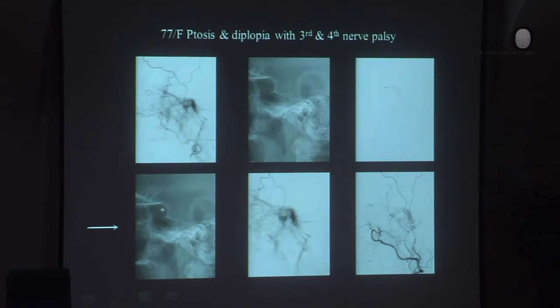Recently, I personally experienced a very strange and serious situation like this, and this is a proliferative phase. We usually touch it minimally in this proliferative phase, but we entered the venous route to reach the flow that comes from this feeder into this area. So I put in just one coil, a hydrocoil, to induce thrombosis. There was a little resistance, but not that tight. And this portion was removed, and I introduced particles intraarterially. And then the patient recovered, but had decreased vision. It was tolerable, but anyway, the vision decreased.